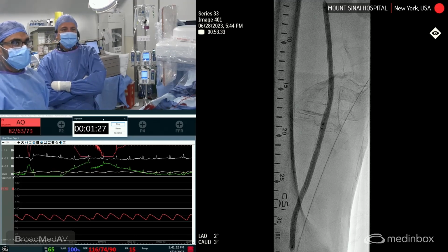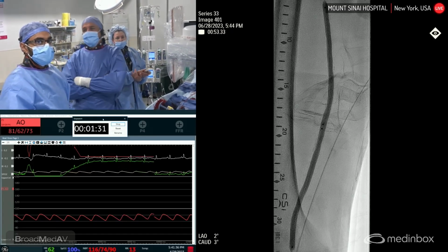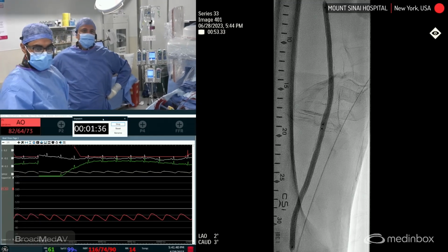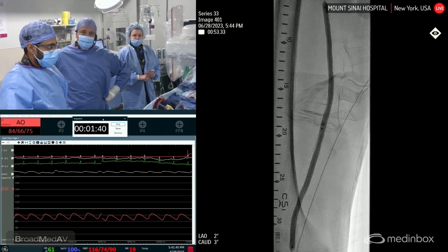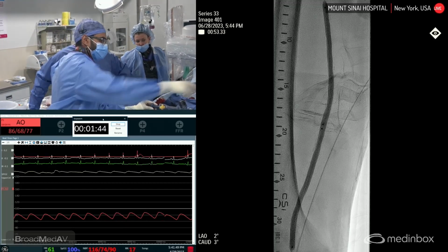Is he bradycardic, or is it my imagination? One of the things you have to watch for is obviously vagal bradycardia. So in this situation, there is no vagal bradycardia. So that's good. No, 1.5 minutes. No, 1 minute, 20 seconds. That's only.